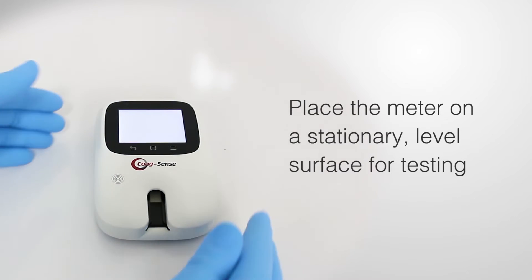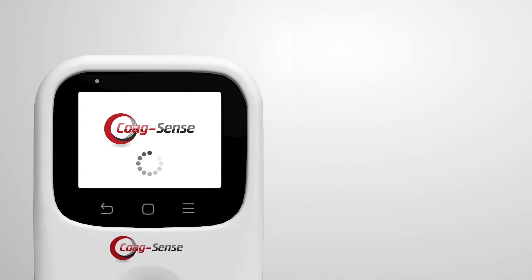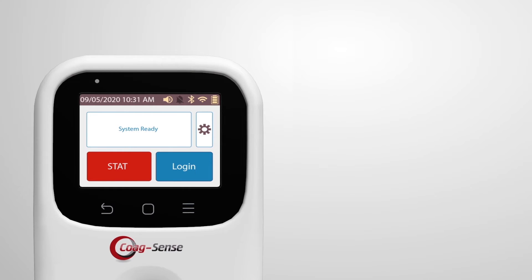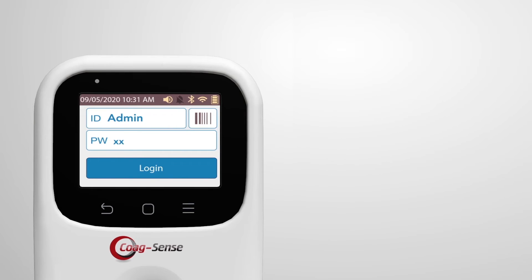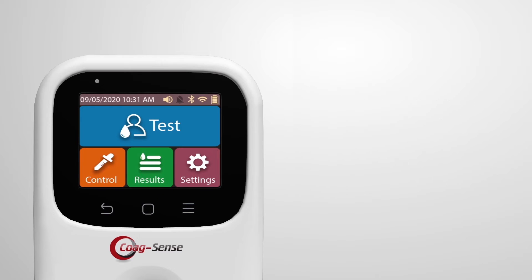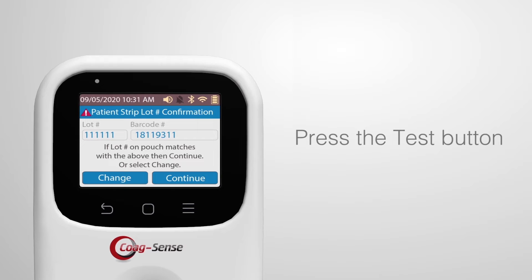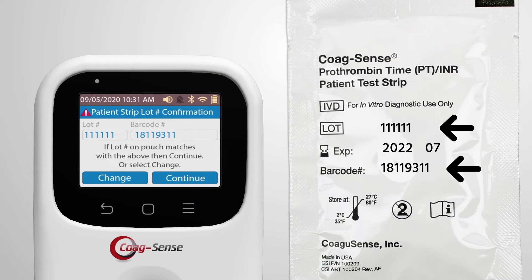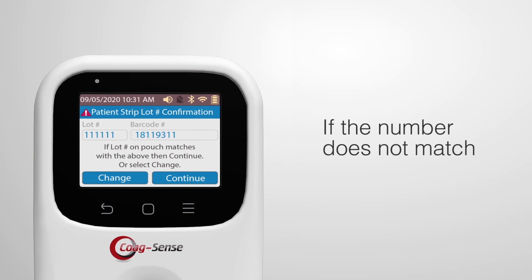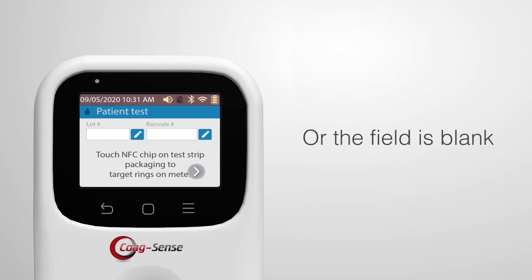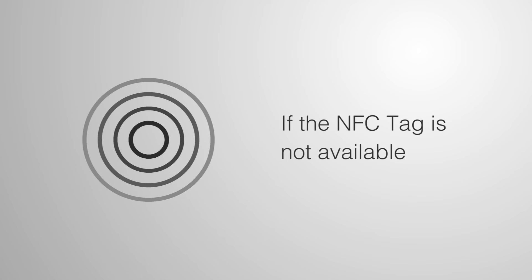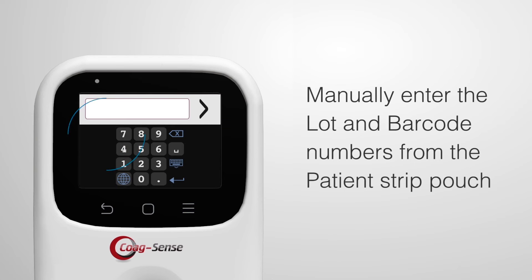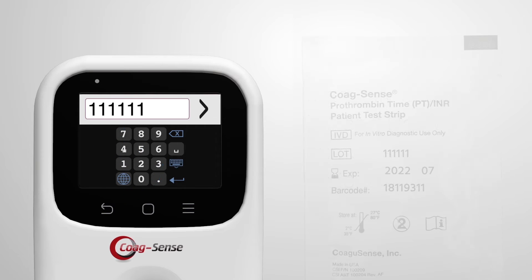Place the meter on a stationary, level surface for testing. When the system finishes starting up, the login screen will be displayed. Log in as admin or using your assigned credentials. This login setting can be changed to auto-login based on user preference. Press the test button on the color touchscreen. Confirm that the patient strip lot number and barcode number displayed match the information on the test strip pouch. If the number does not match or the field is blank, touch the NFC tag to the NFC scanner on the meter. If the NFC tag is not available, manually enter the lot and barcode numbers from the patient test strip pouch.